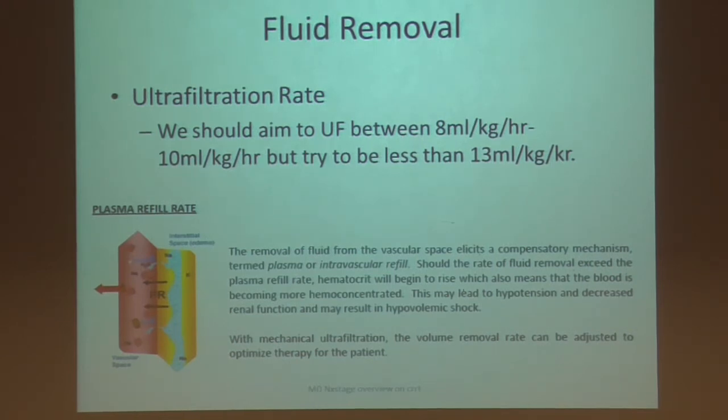So a net UF, I like to stay pretty conservative, about 200 net an hour. So you're still running about 500-600. So I stay around the 8 ml per kilo per hour for safety. I'd rather run them a little bit longer if I have to.